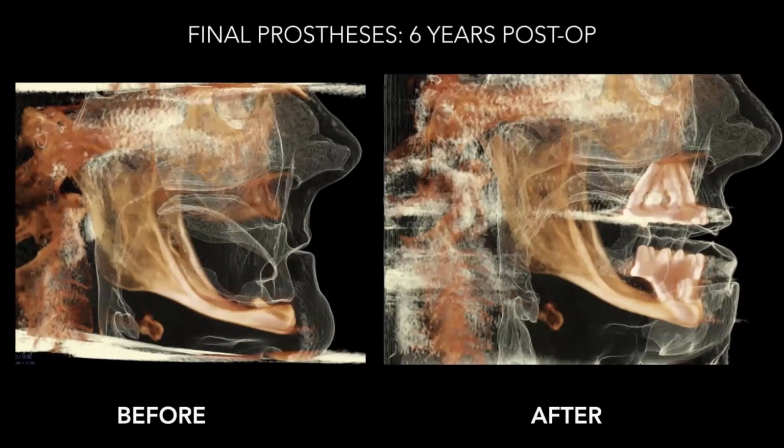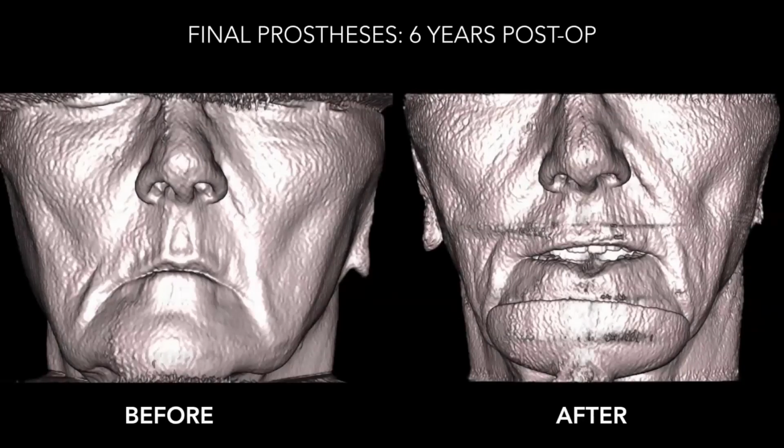And you can see before and after what this looks like, and what we were able to provide for the patient. You can see the difference in her lip profile or chin profile, and you can tell a lot from these images. They really help make sure that you drive a lot of these points home. And this patient has been with our clinic now for over 8 years, and she sent her sister, who had similar problems, and we were able to treat her as well. And that was just more recently.